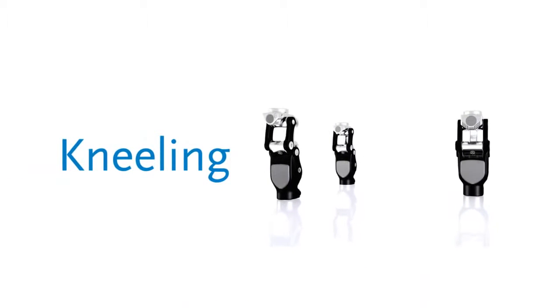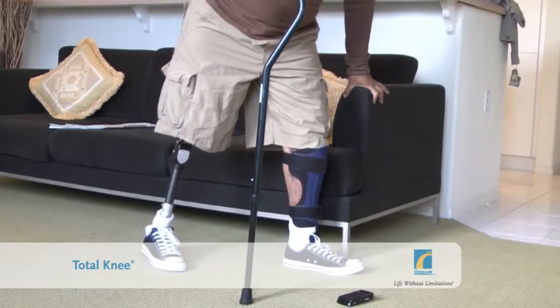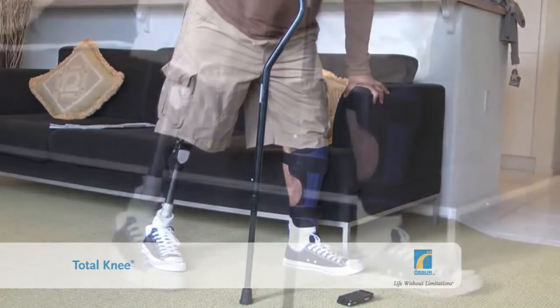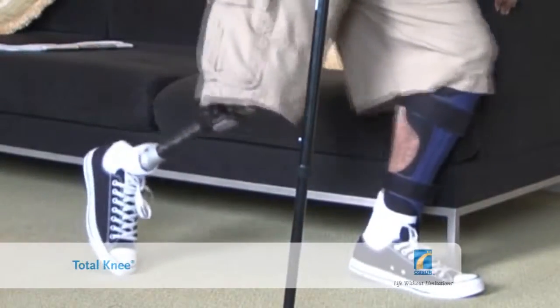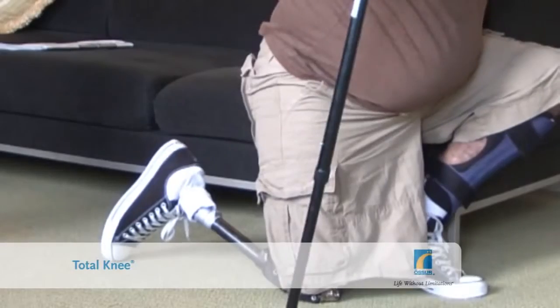Kneeling. To kneel, take one step forward with the sound limb. Unlock the knee by shifting your weight forward onto the ball of the prosthetic foot. Lower yourself gently down using your sound limb until your total knee is on the ground.